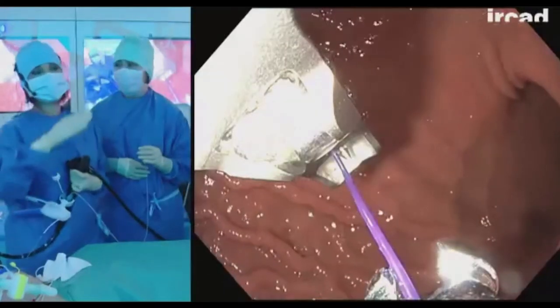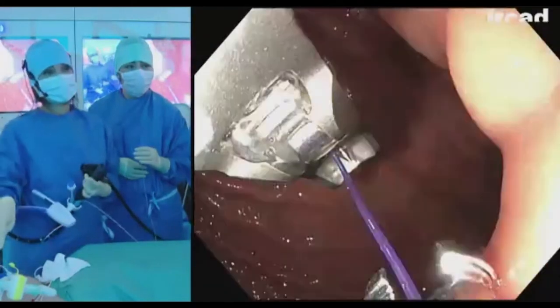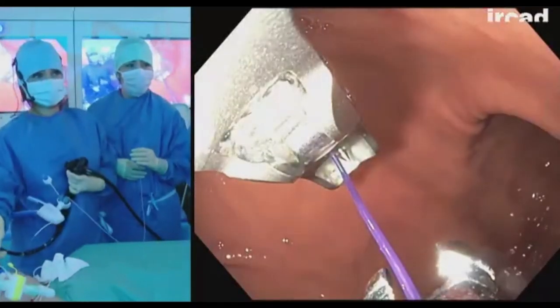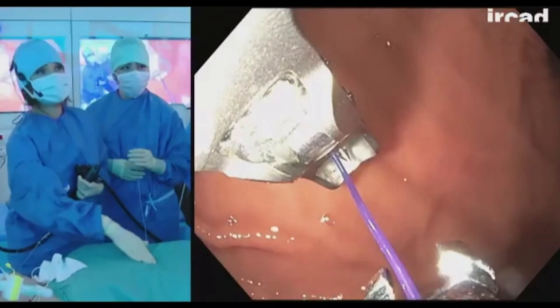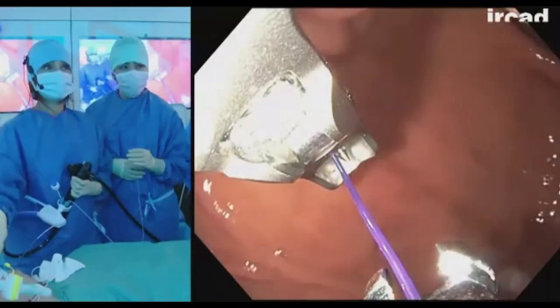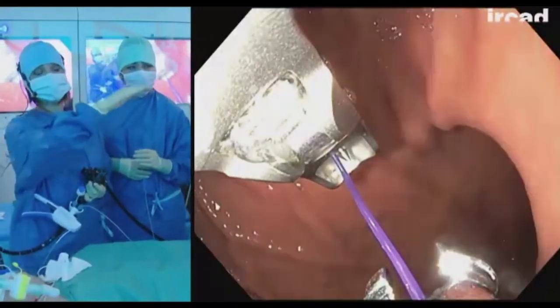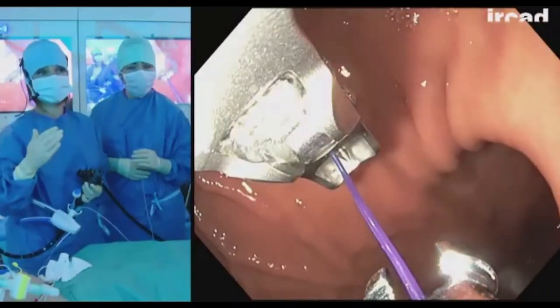So a little bit of orientation. You can see here on the right side of the screen, I have the incisura, and this is where we're gonna start the procedure. We have the anterior wall of the stomach, and those are the two main landmarks. So we're gonna spare the antrum and really start at the level of this arch, the incisura of the stomach.